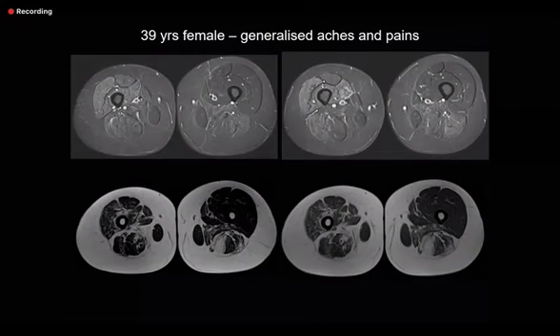Okay. Right. So the point is that this is myositis, and myositis is an exam case. Why is it an exam case? Now, in myositis, when the patient comes to the rheumatologist, they do CKs and all those things, and they will send the patient for MR. The key concept you have to remember for your exam is that the sequences for myositis which we do are just STIR and T1. That's all. You don't need to do anything else.